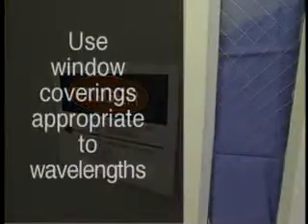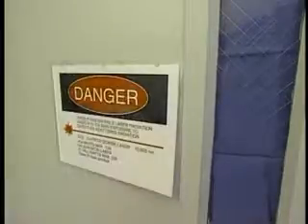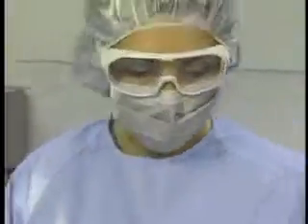Protective eyewear may include goggles or face shields. Prescriptive glasses may be worn if they were manufactured by a laser goggle manufacturer and coded for a specific wavelength. Be sure the sides are protected from beam entry. The eyewear should be labeled with the wavelength for which protection is provided and the optical density.